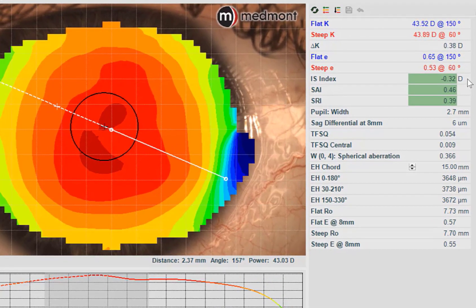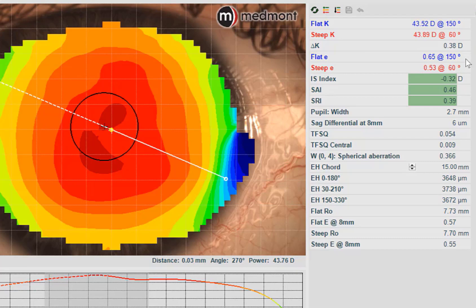The disease detection indices are all lit up in green, telling us this is an absolutely normal eye shape. With a glance at the Attributes window, we learn quite a lot. If we're fitting a rigid lens — maybe a corneal GP, a GP multifocal, or an ortho-K lens — the eccentricity differences and the SAG differential tell us the peripheral cornea is a very normal shape. The rate of flattening is well within the middle of the bell curve. This patient probably doesn't need an abnormally flat or steep peripheral curve in a rigid contact lens.